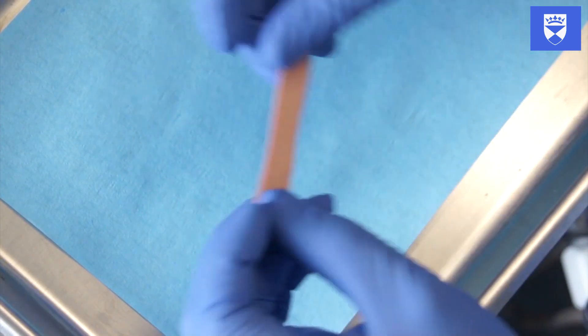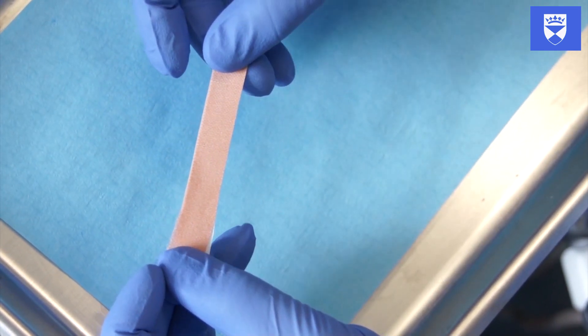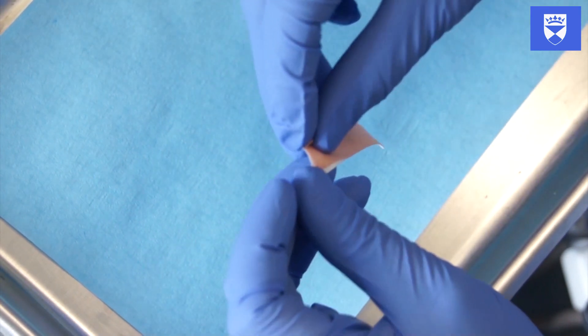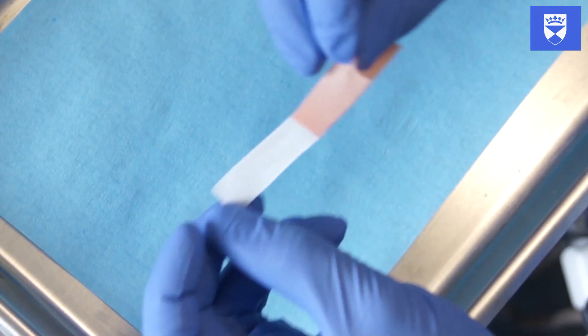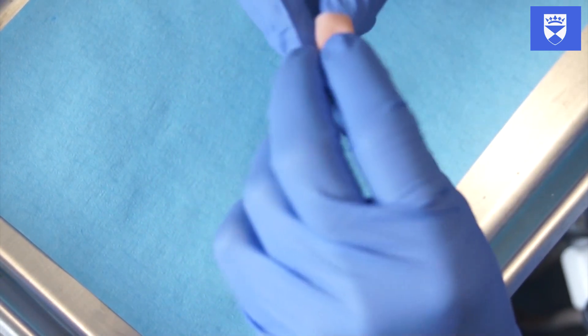Two common methods are to place a sheet of gauze in the oral cavity, or alternatively to affix the crown to your finger with a piece of adhesive tape. This is the method demonstrated in the video. If you are using adhesive tape, it is important to ensure that the patient does not have an allergy to elastoplast.